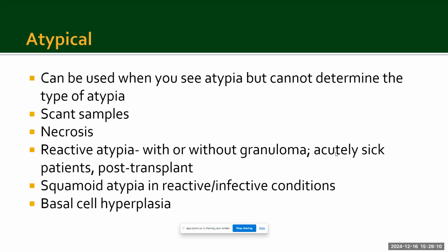Yes, these small cytology samples can be really challenging. So just to add on that, I would like to ask another question. That is, how do you approach the cytological evaluation of different types of lung cancers in these small cytology samples?